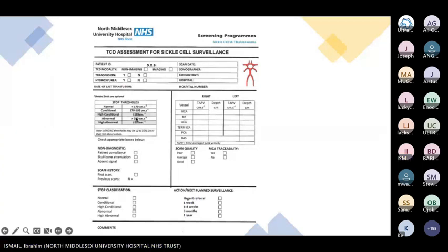So if you have a patient with, say, conditional results, then it would account for a 3 months visit following the examination. Write it in the comments. I will go into the next course of action in the tree, as I mentioned earlier, which will give you more insight into the planning involved for the patient.